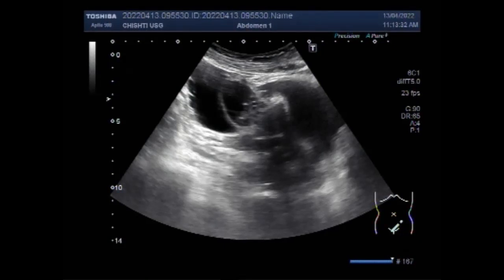Dear viewers, I hope you are all fine. This ultrasound video shows a large ovarian cyst having a daughter cyst and a large ovarian mass.